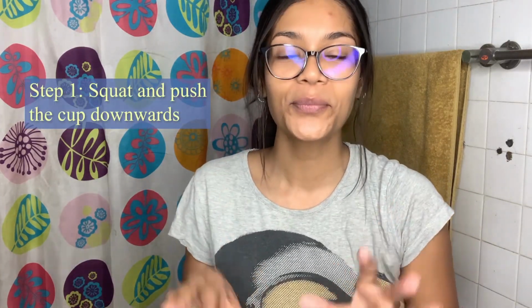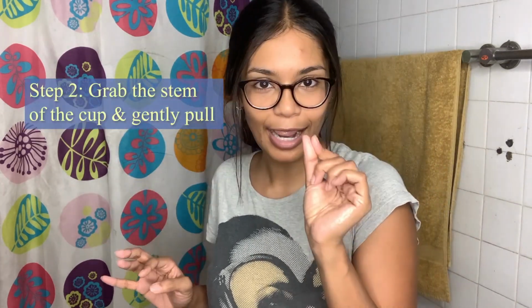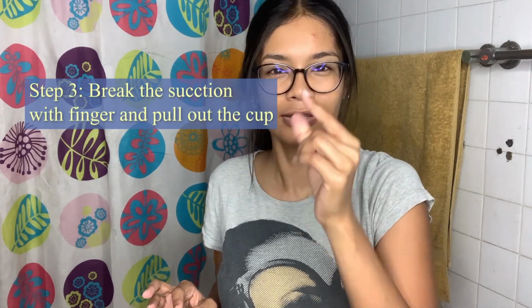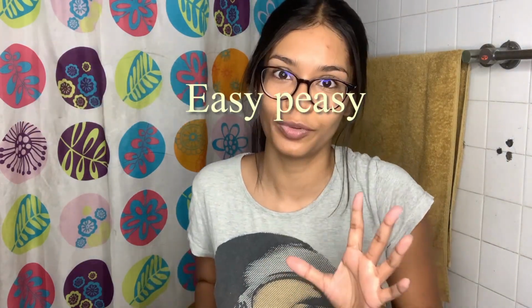So my tips for taking it out. First is squat down and really push down. Push it downwards so that it comes lower. Otherwise it gets lost and people are like, oh my god, where did it go? Push it downwards and squat so that it's easier. Grab the stem and then once you grab the stem, pull it a little bit, insert your finger, break the seal and then it easily comes out. It's super easy. So let's do it.